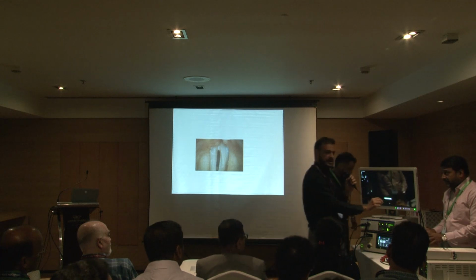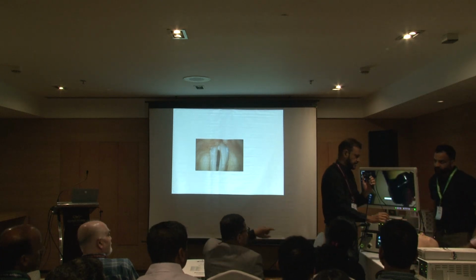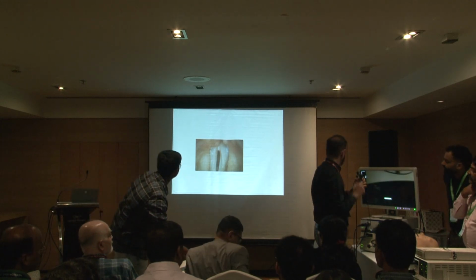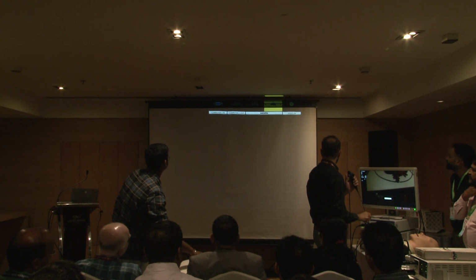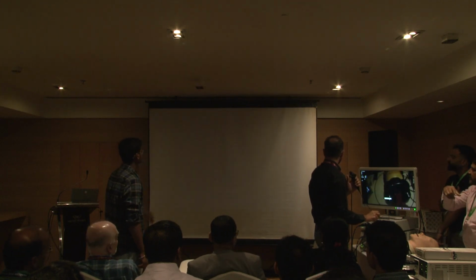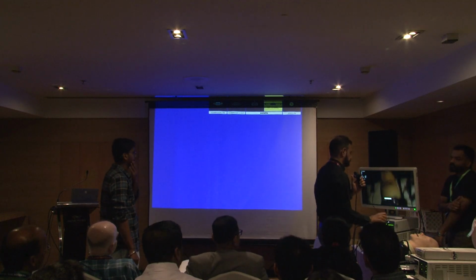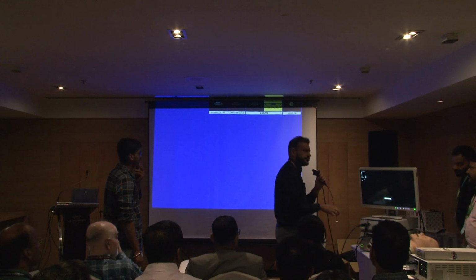So as we go inside, I want to make a small point here.